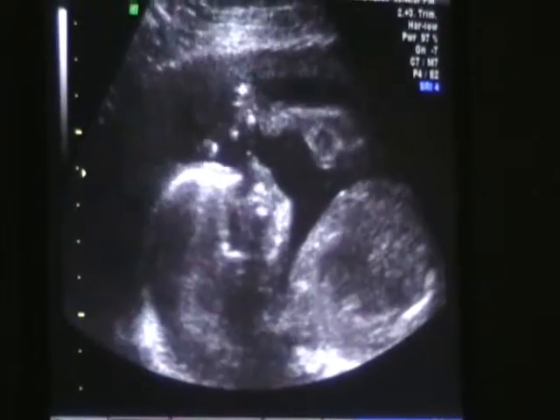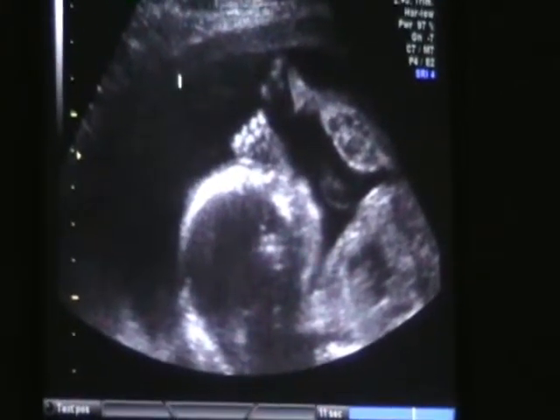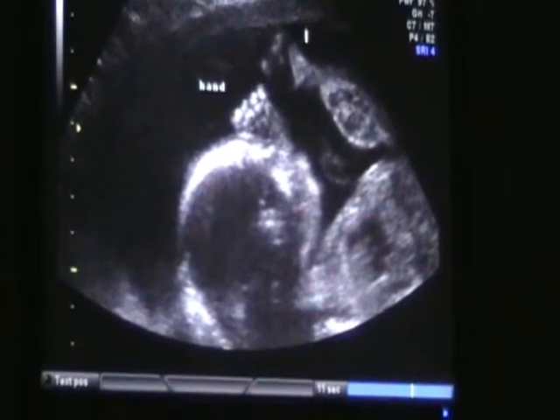That's a foot. That's so funny. There's her hand — see her hand? I'll give you this picture here because this is a hand. And then this is actually a foot.